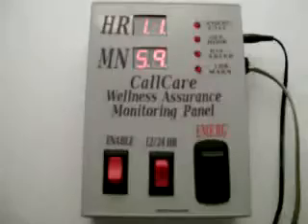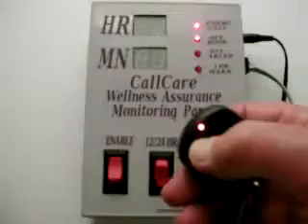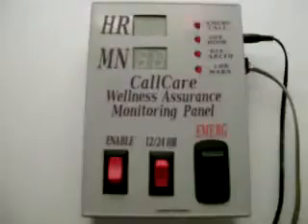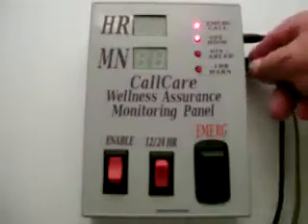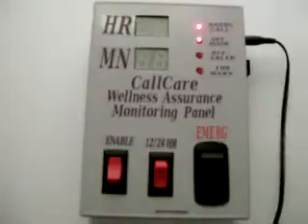I will now demonstrate the emergency call sequence using the RF pendant. Holding down the A button for at least a second initiates the sequence. The first thing you will notice is the warning buzzer, alerting you that the emergency call is being placed. We see the off-hook LED as the panel grabs the phone line, and the emergency call LED lights to show the numbers dialing of the first of your 2 designated contact phone numbers.